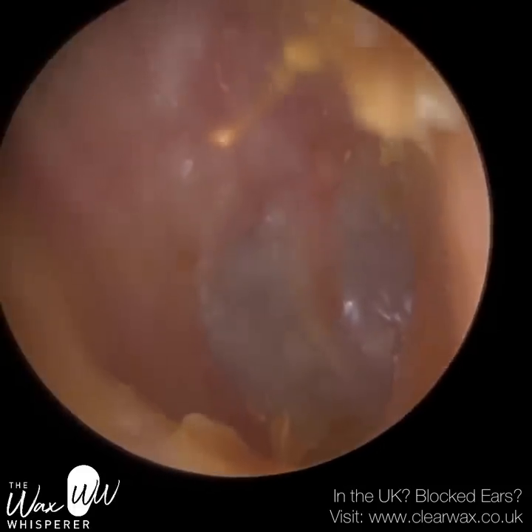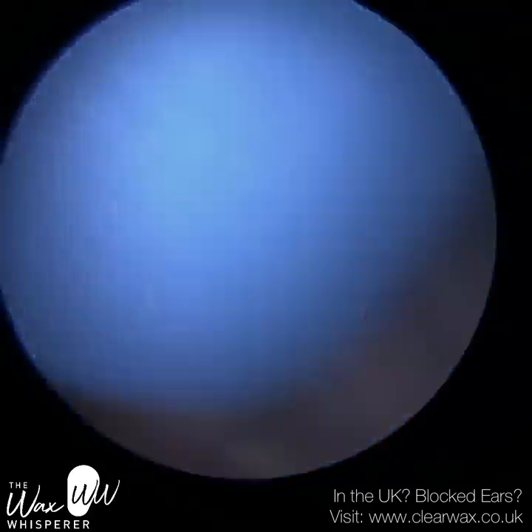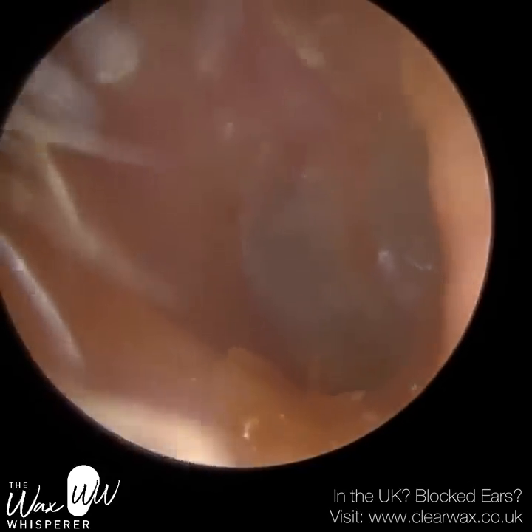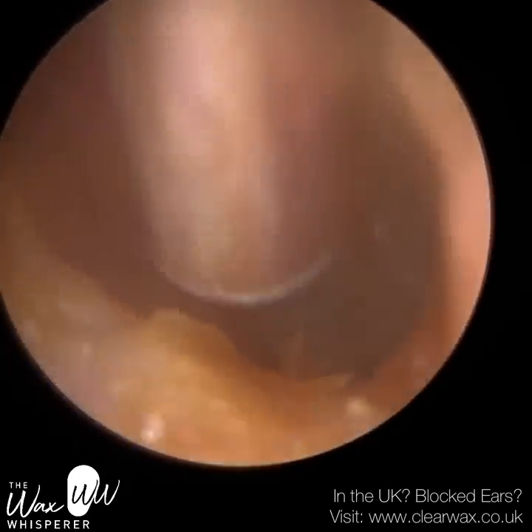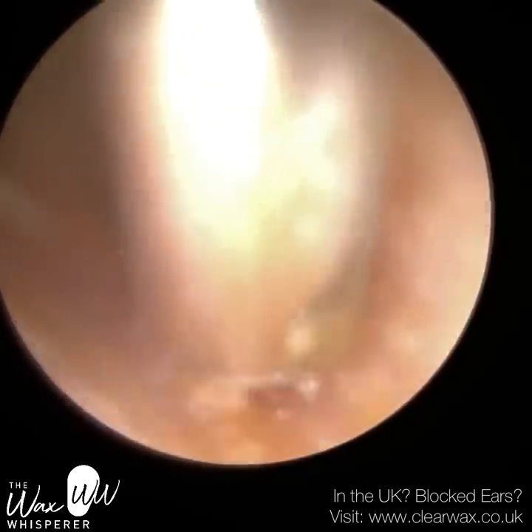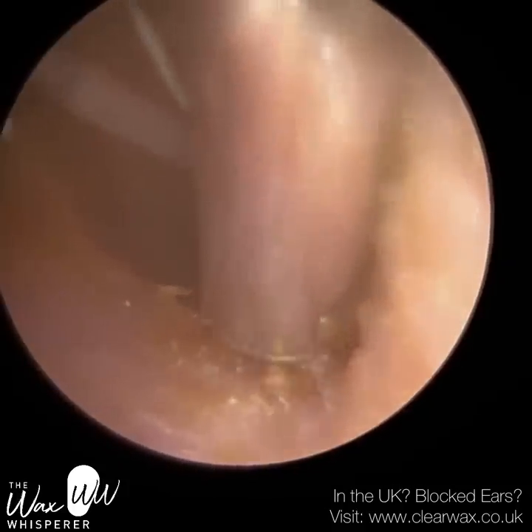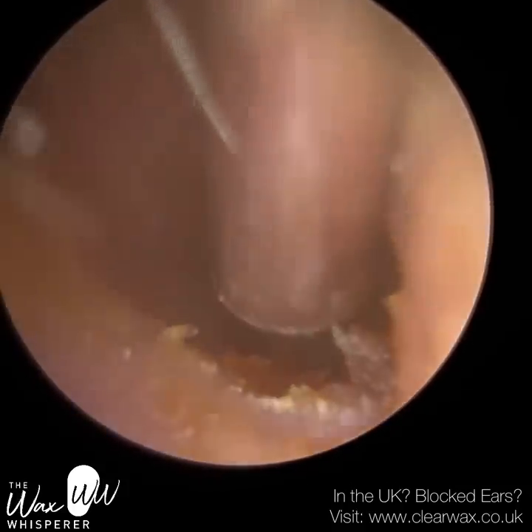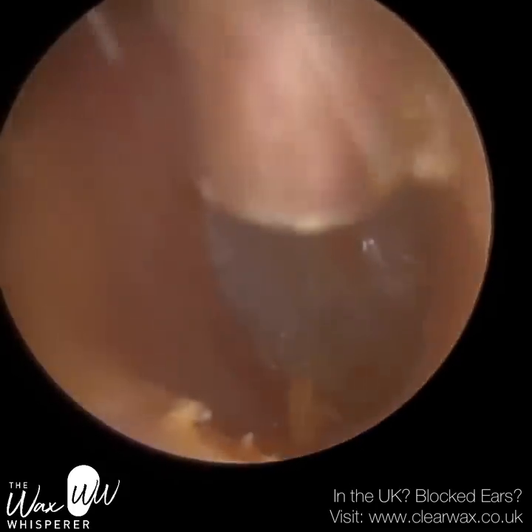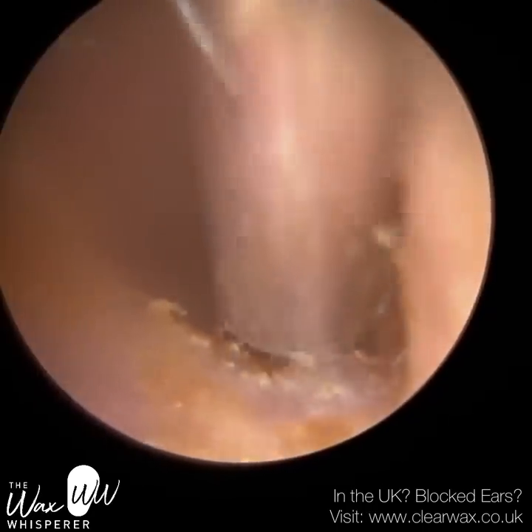That's the patient's eardrum — it's fully visible and looks healthy. I'm just going to mop up around the edge. I'm going to attach the fine-end suction probe to get access into the deeper part of the ear canal. So this is that midsection — this is where the ear canal narrows. It's where the cartilage portion and the bony part of the ear canal meet. We call this region the isthmus.